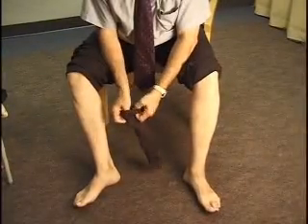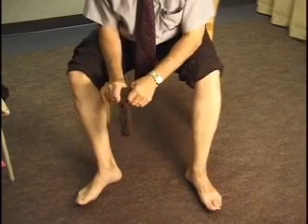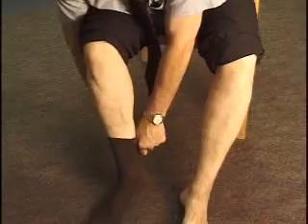Some individuals who have strong hands without arthritis can put the stocking on without using the gloves. Here again, the stocking is rocked back and forth over the foot and pulled up over the ankle. Grabbing it on both sides and pulling at the same time little by little without overstretching the stocking, it can be fully applied without a problem. The tip of the stocking should be carefully straightened in order to avoid any pressure on the toes.